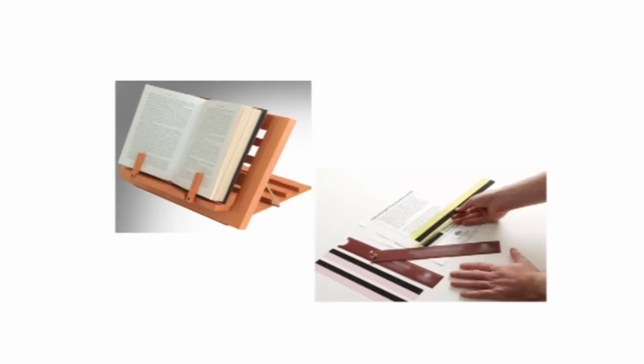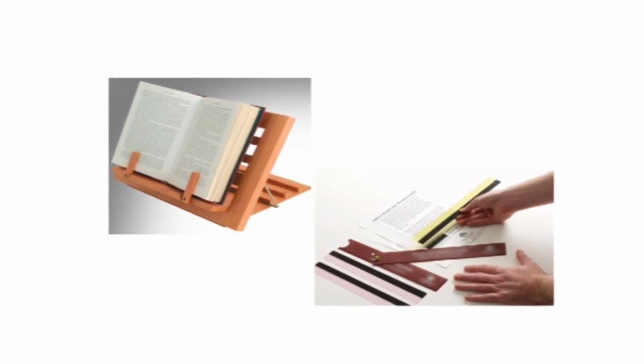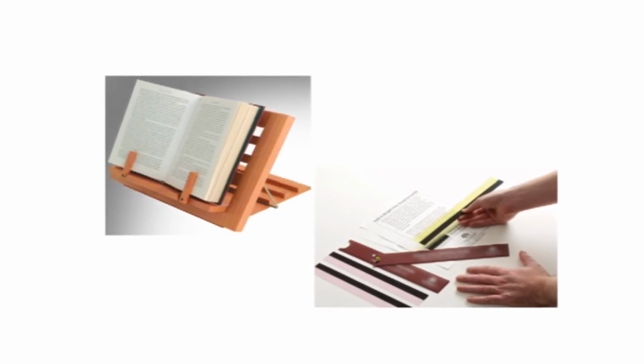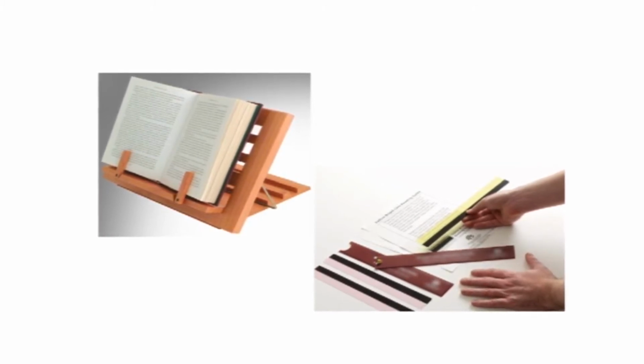Non-optical devices. In non-optical devices, lenses are not used like all low vision devices, and the aim is to make low vision people's lives easier. They are designed to promote independent living. We will now discuss each device one by one.